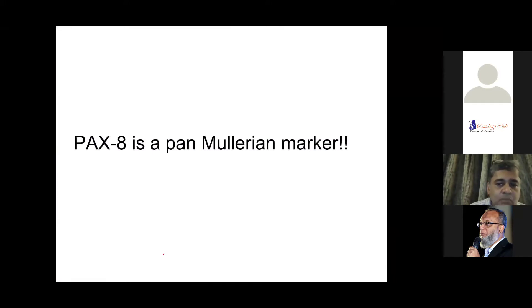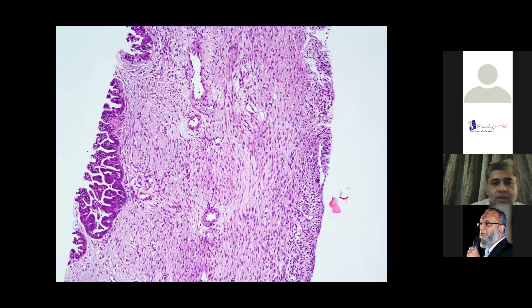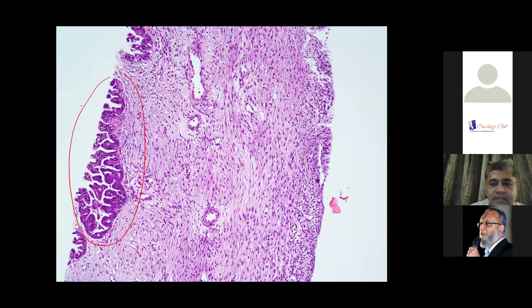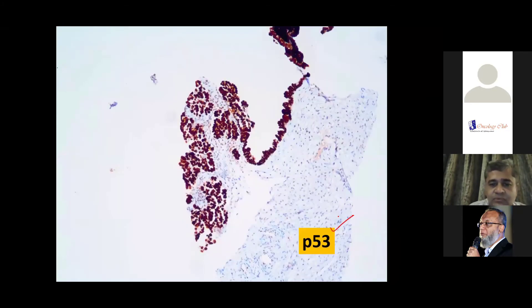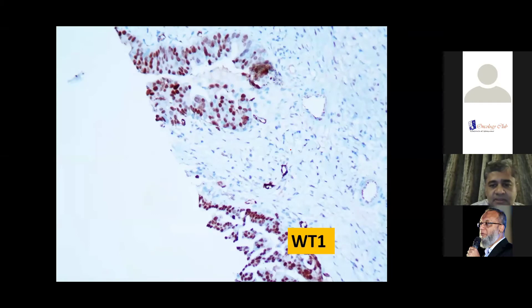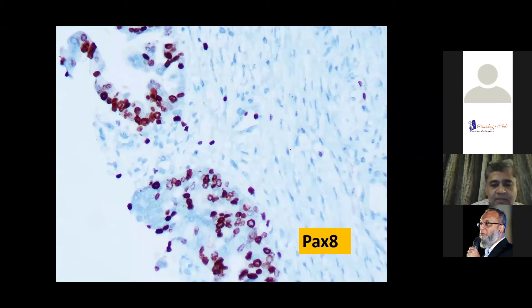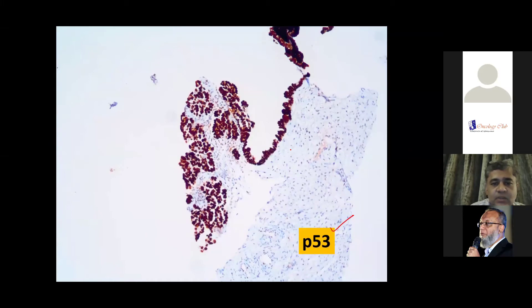Another picture shows a biopsy of an adnexal mass with adenocarcinoma at the edge. These are very malignant-looking cells. P53 staining needs to be interpreted properly — if you look at the nuclei of all tumor cells, they are very strongly and brightly brown, diffusely positive. This is a P53 mutant tumor, which occurs in high-grade serous cancer with P53 mutation. This is WT1 positive — a serous marker — and PAX8 positive — a Müllerian marker. So we have a Müllerian tumor expressing WT1 and showing P53 mutation, making it a high-grade serous adenocarcinoma of the ovary.